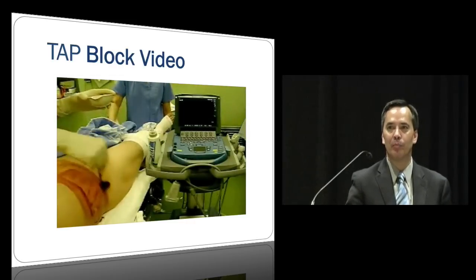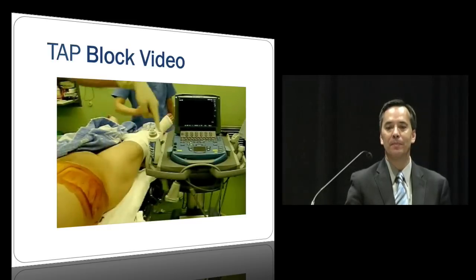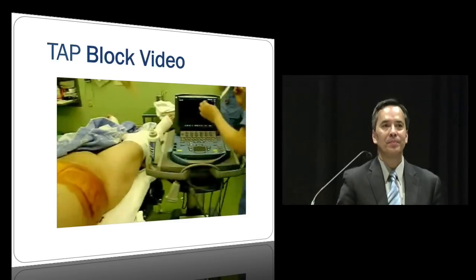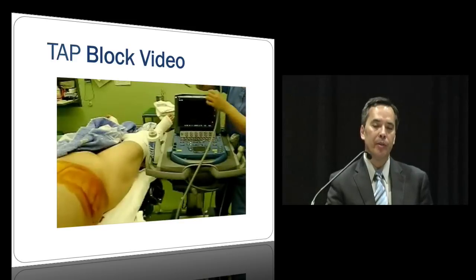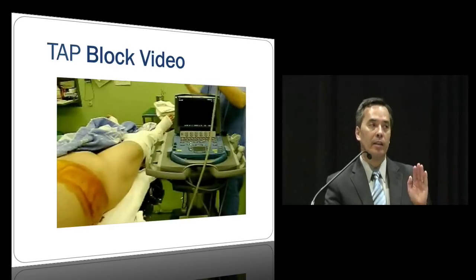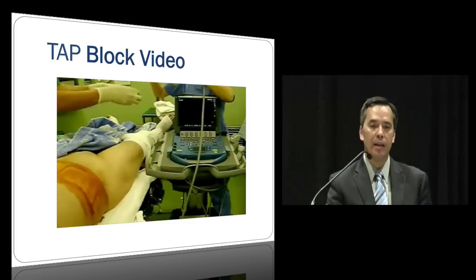You almost need a block room to do that, or have the time to be able to do it. And it's showing some things where they're putting the gel into the sterile sleeve. So they're getting ready to put the probe in there. And then I personally like to get the sterile conductance gel and put that on the outside too. It makes it a lot easier.